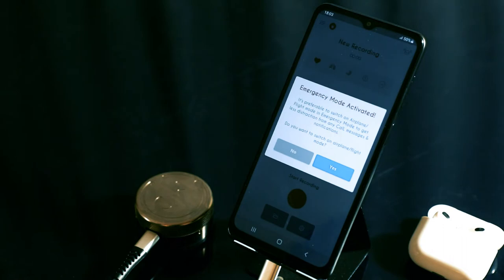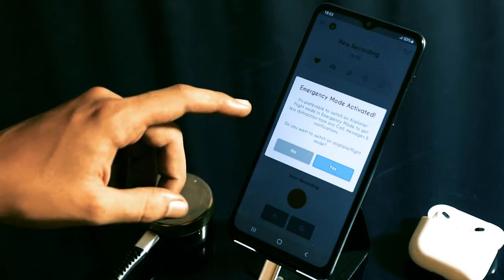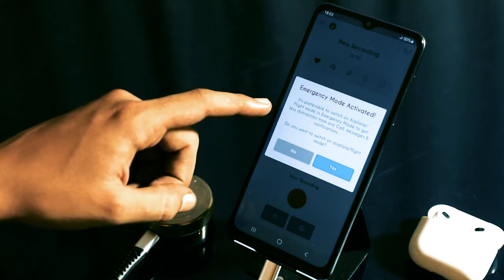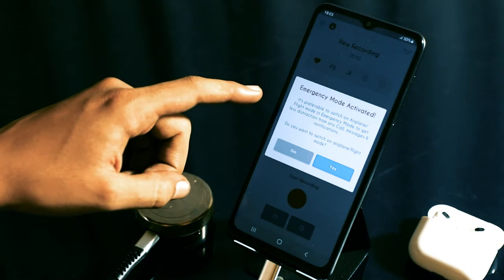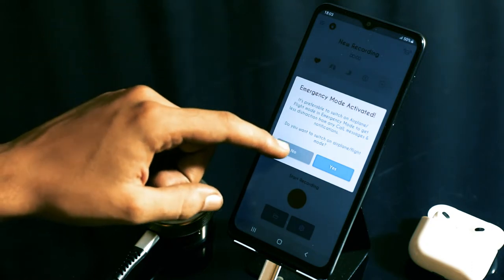The emergency mode is used when you want to do a quick auscultation of many subjects. When you activate the emergency mode, it will ask you if you would like to go into airplane mode. Choose based on your preference.